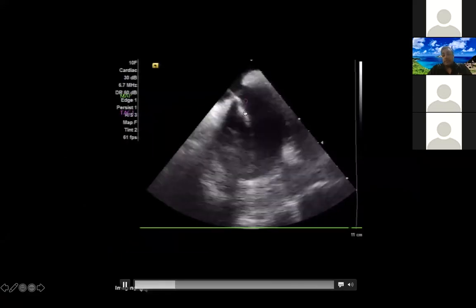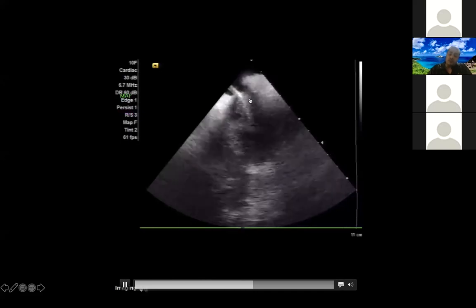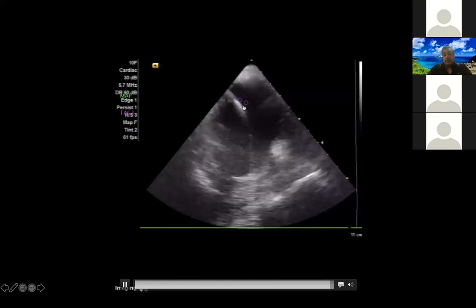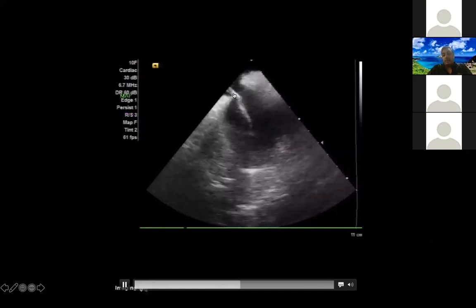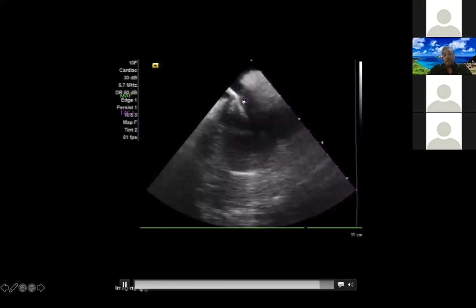Another little thing, there are lots of different ways that you can mark where your transeptal is. You can take a contour if you're using CARTOSOUND of the actual sheath, as long as it's in plane. You can actually take a point right where you've crossed. So if you do lose your transeptal, you can come back to that point.